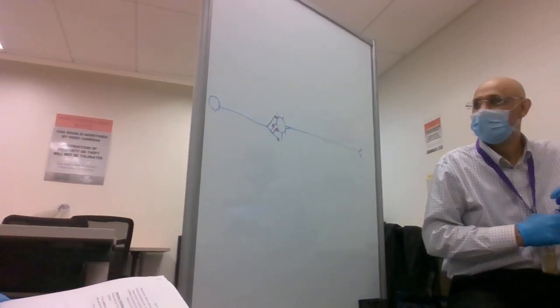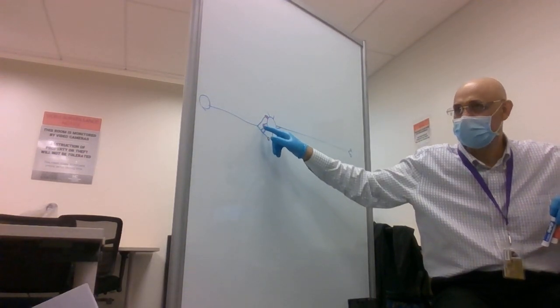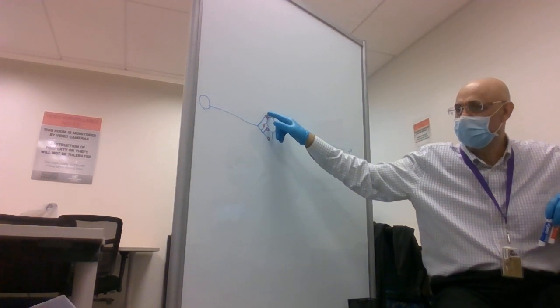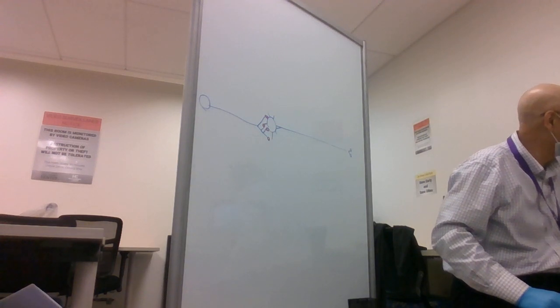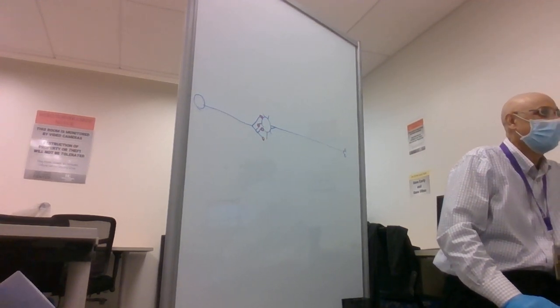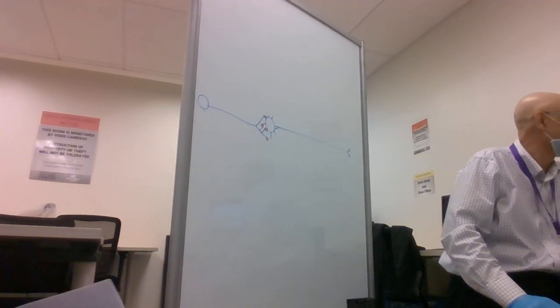You guys good? What is the last portion of the axon called? These are called the axon terminals. They are attached to either the cell body or the dendrites, isn't it? So the reason I went over the whole thing is: what are these pink structures attached to the dendrites and the cell bodies? Axon terminals. They're not the dendrites.